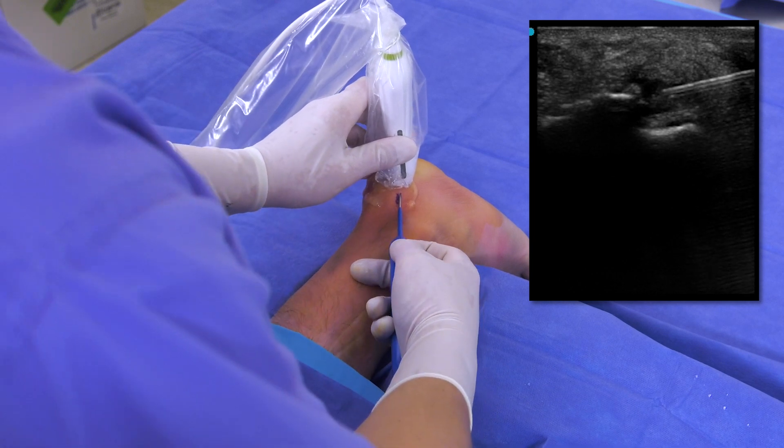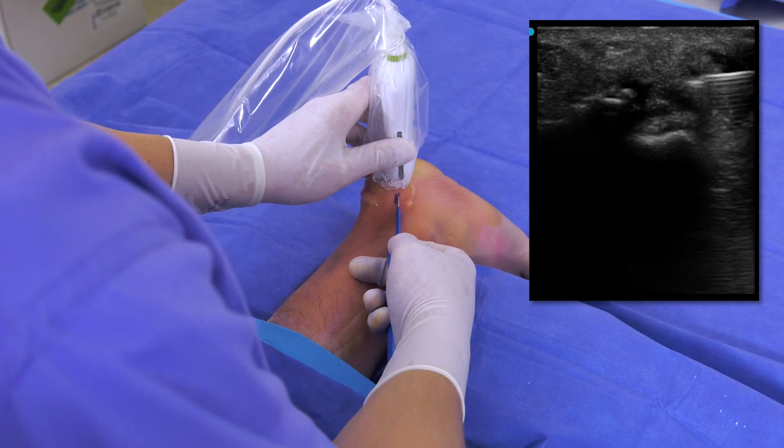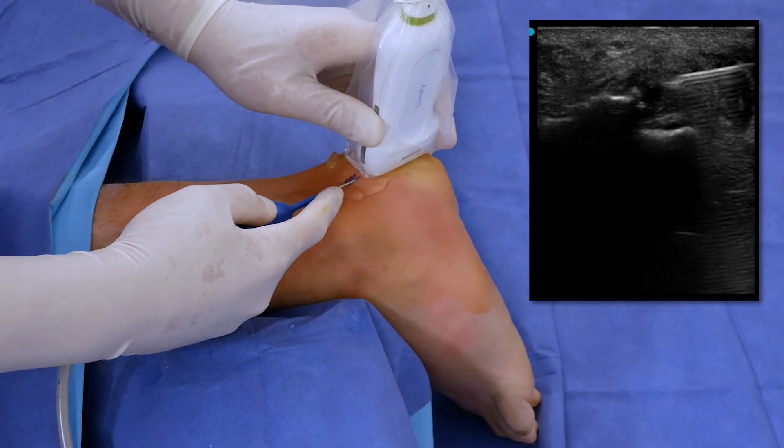This delivers a high velocity stream of saline to debride and evacuate the diseased tissue from the site. By moving the device in an axial motion I can reach and debride all the damaged and pain-inducing tissue.